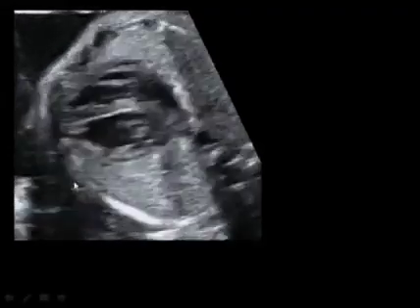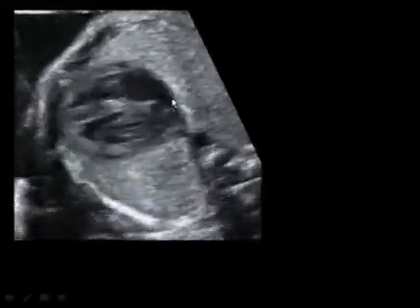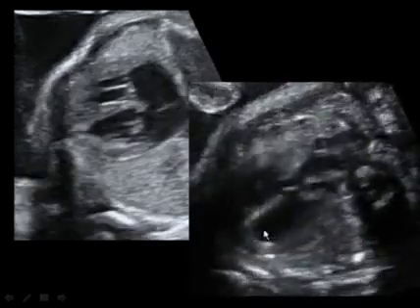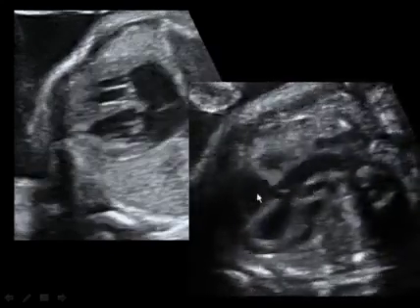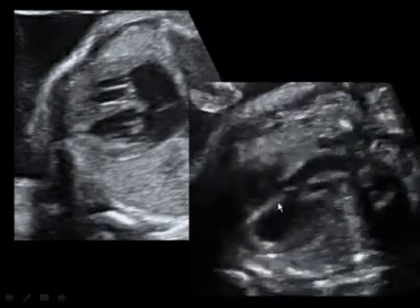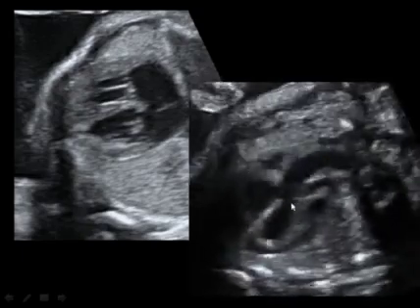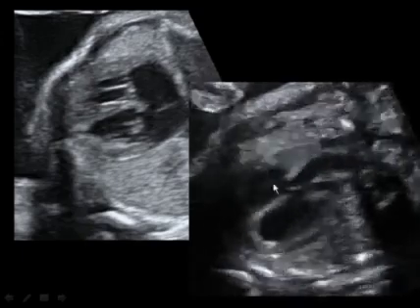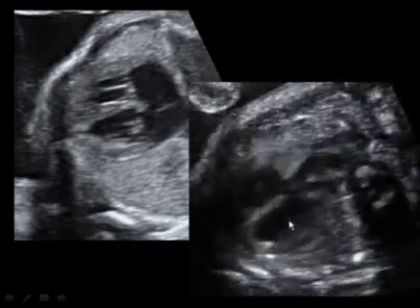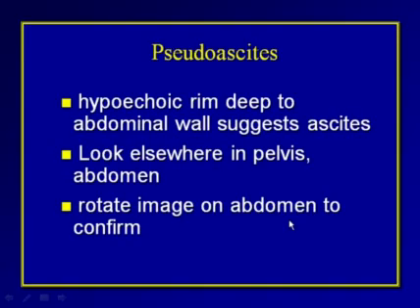Here's another patient. We see a four-chamber view. Looks beautiful. But when we look at the image of the aorta, we can see now, when we follow with both right and left ventricles on the image to see the ascending aorta, that there's an overriding aorta here and a ventricular septal defect, and we're then able to identify the overriding aorta in tetralogy of Fallot.